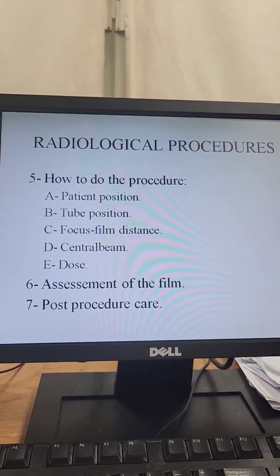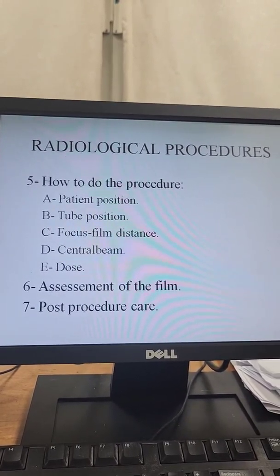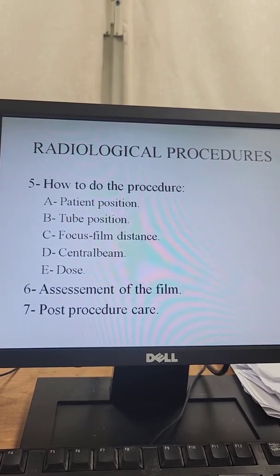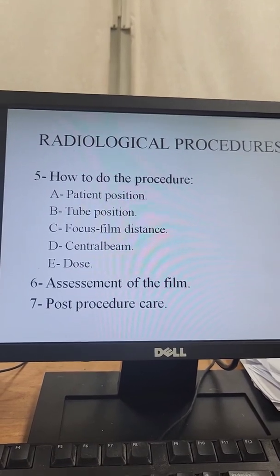Post-procedure care: no post-procedure care, just examine the patient for any possibility of contrast hazards or contrast reaction, and ask the patient to take care of the possibility of delayed contrast reaction, and also to take care of the antecubital cannula.